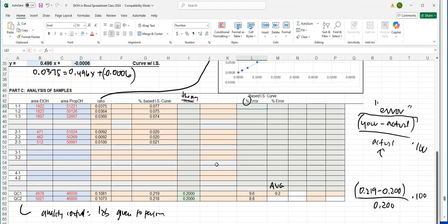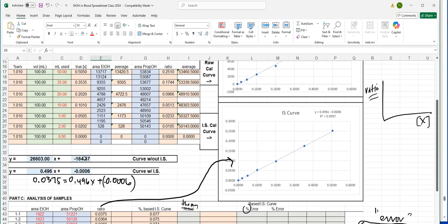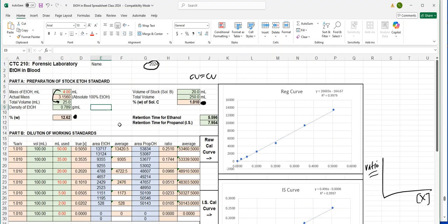All right, so I think that's all I need to say about BAC. This has probably been one of the longest lab videos that we have ever done in my life. But it's okay. There was a lot of stuff that's going on. Just keep in mind that your lab data is not the same as I entered in here. You've got to go by your batch. You've got to go by what your samples are telling you. Even up here in the dilution section, you've got to go by what we actually did when we did the videos. So with that said, good luck on the BAC analysis and the spreadsheet.